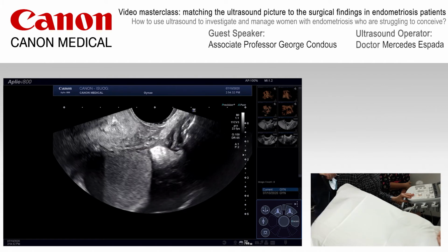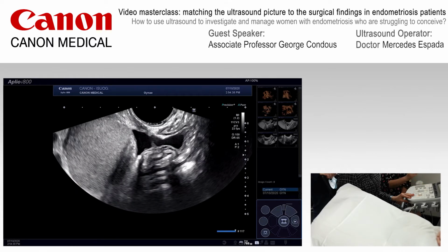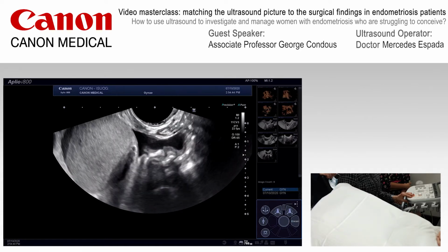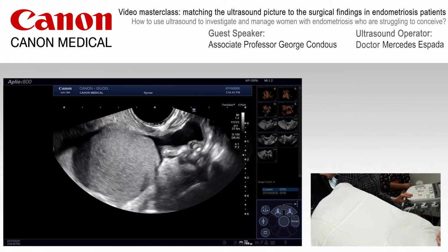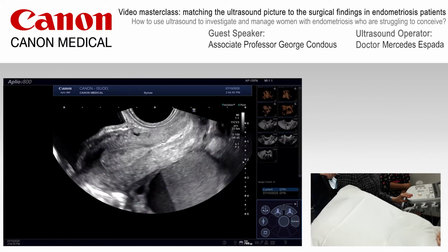So we can see that that nodule's fixed to the left, probably uterosacral lesion. So too is the left ovarian endometrioma. So we've got partial obliteration to the left of the midline, and as we move that probe towards the right, we can see that there's some fluid present and the rectal wall itself moves more freely. So we've got a hemipelvis, preferentially on the left side, that appears to be obliterated with the presence of rectouterine adhesions.